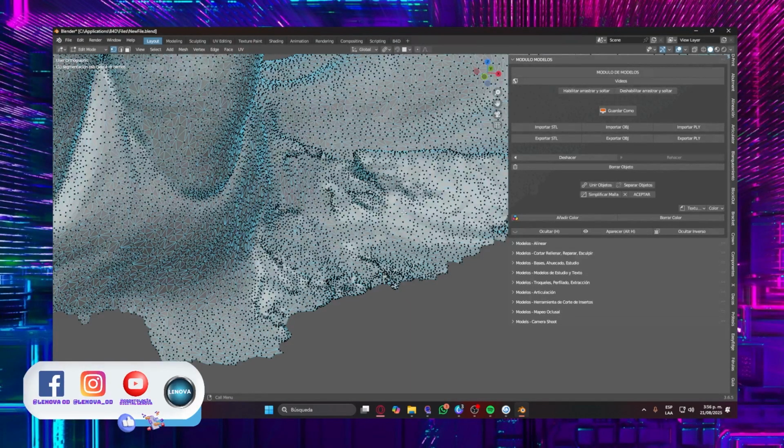It's not about using the economical option, right? But believe me, a scanner pays for itself. Nowadays, it pays for itself. So it's good to go with a highly recommended Panda, especially for implantology, because it scans metal beautifully. While the Medit obviously is a much higher range, even more recommended because it has an interface recognition algorithm. It's a topographic map that's cutting edge technology. Not even the other brands, which are also good, have that.